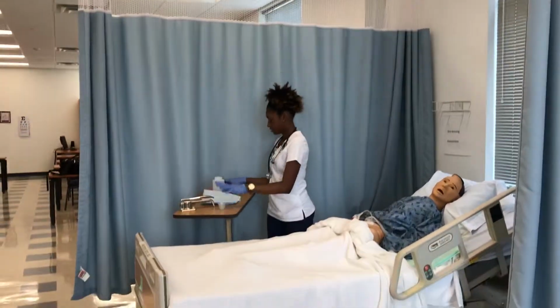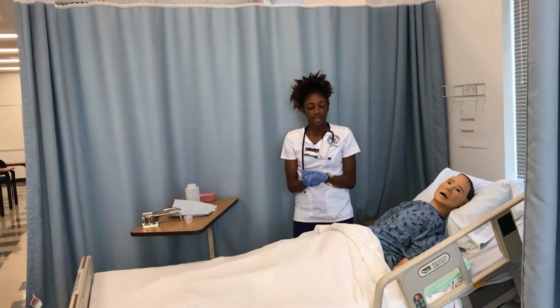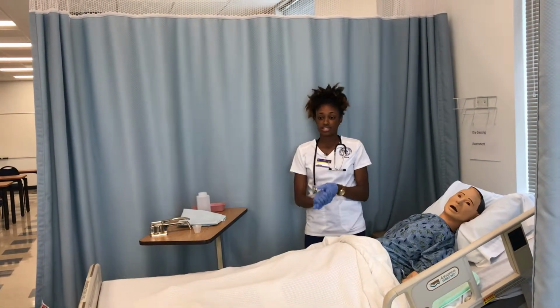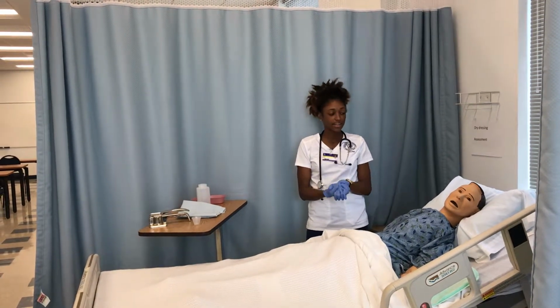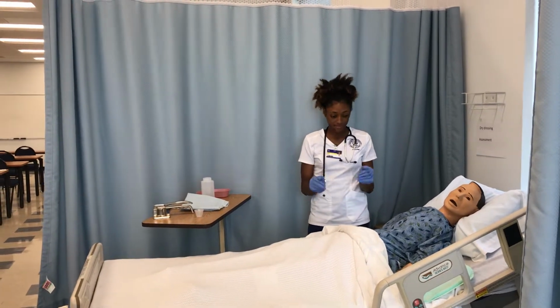The things I'm going to document are patient tolerance, the type of nutrition, the Jevity, the medication I administered, the amount of fluid I put in to the PEG tube, and the date and time.